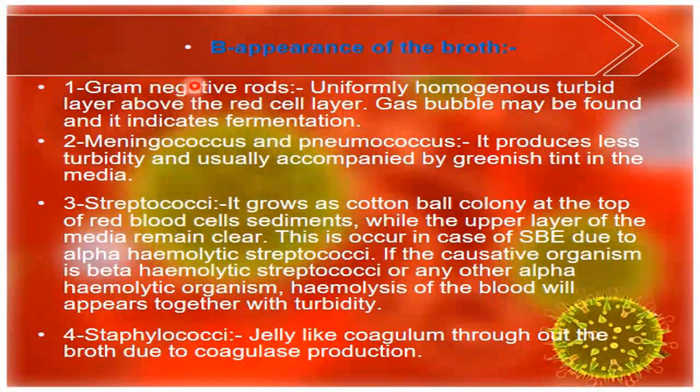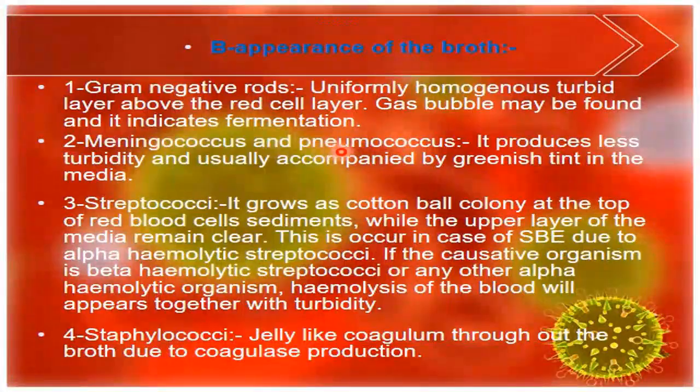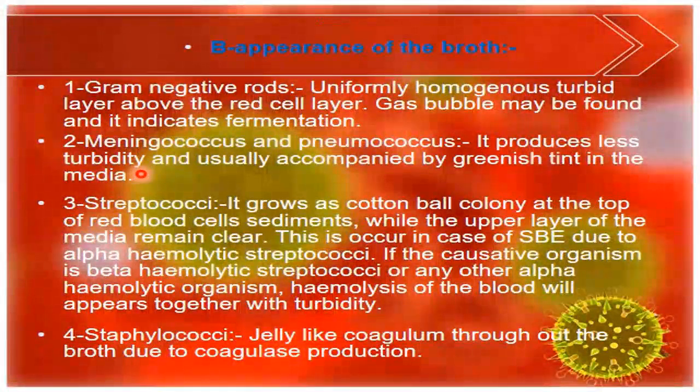In case of meningococcus and pneumococcus, meningococcus means Neisseria meningitidis, and pneumococcus means pneumonia caused by Streptococcus pneumoniae. Meningitis is caused by Neisseria meningitidis and pneumonia by Streptococcus pneumoniae. It produces less turbidity and is usually accompanied by a greenish tint in the media.